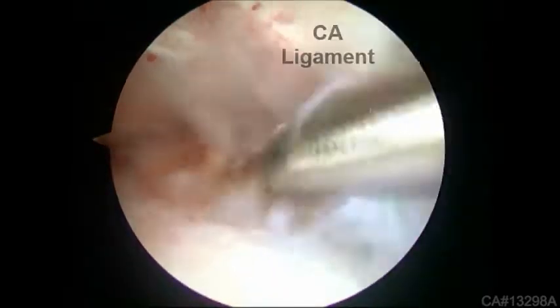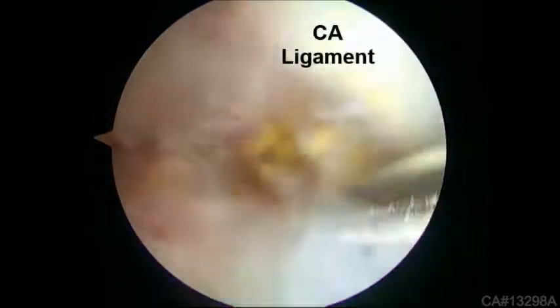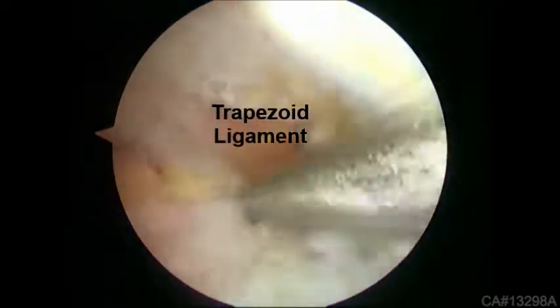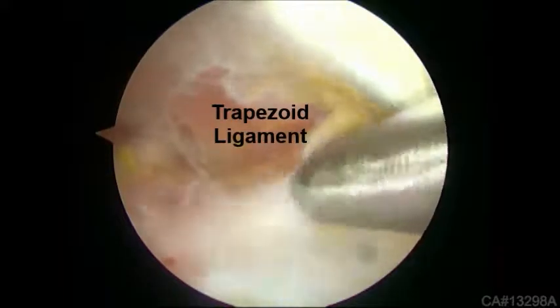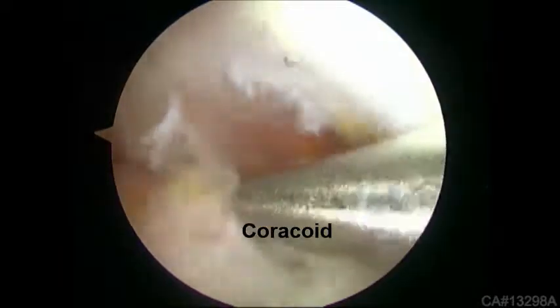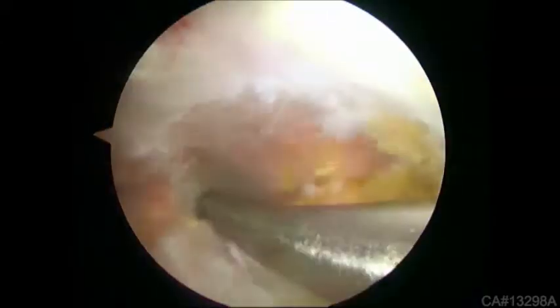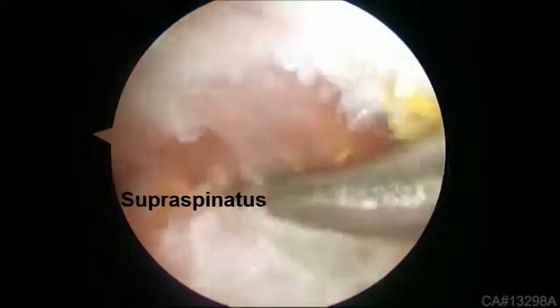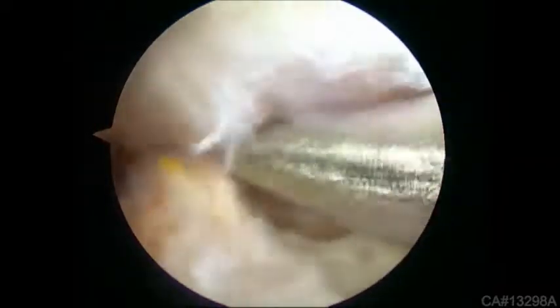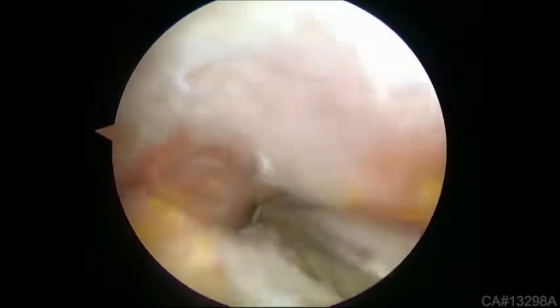The release begins by following the CA ligament to its attachment on the coracoid using a motorized shaver. The coracoid is then followed medially. The next structure encountered is the trapezoid ligament of the coracoclavicular ligaments. The supraspinatus muscle belly is adjacent posteriorly. Between the trapezoid ligament and the supraspinatus muscle there is a consistent fascial band that must be pierced to allow entrance medially, where the neurovascular structures are encountered. Proceed carefully in this area as frequently a plexus of minute veins is encountered.